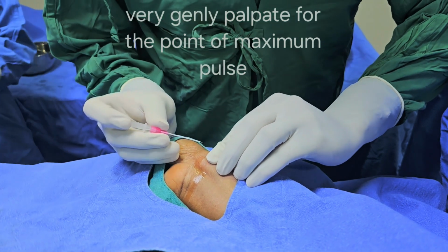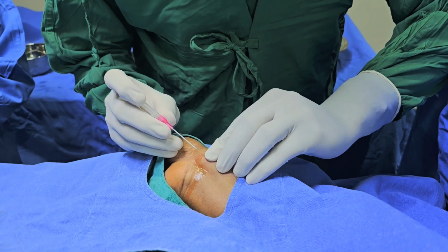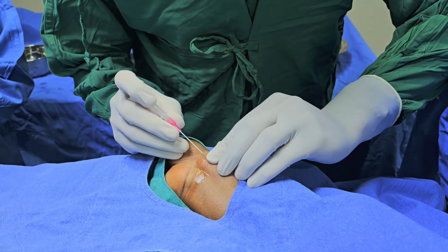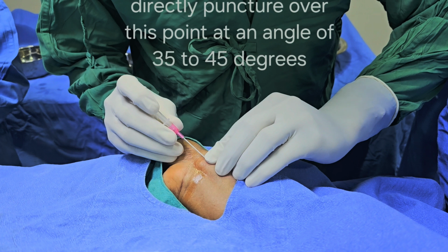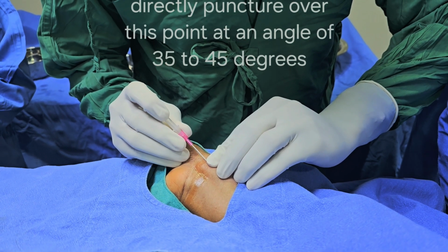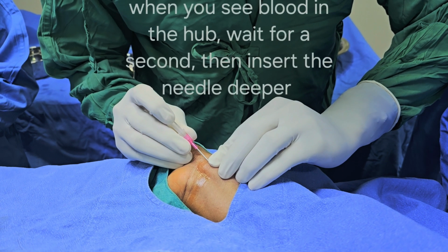After injecting the local anesthesia, palpate the radial artery again very gently, feeling the point of maximal impulse. Directly puncture over this site at an angle of 35 to 45 degrees. Slowly insert the needle in till you see flow of blood into the hub of the puncture needle.